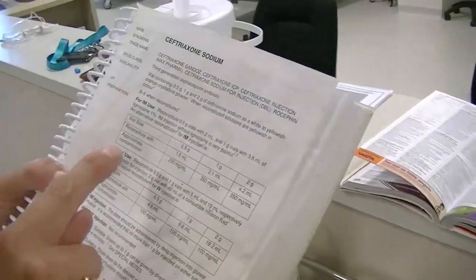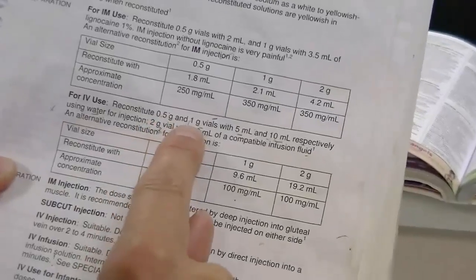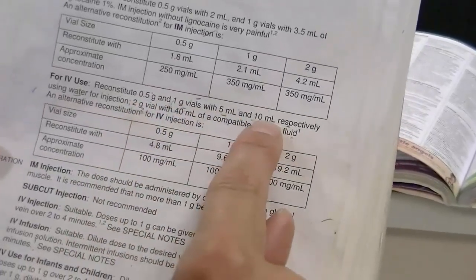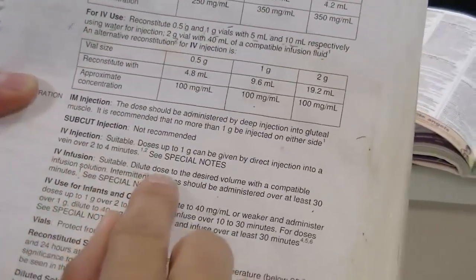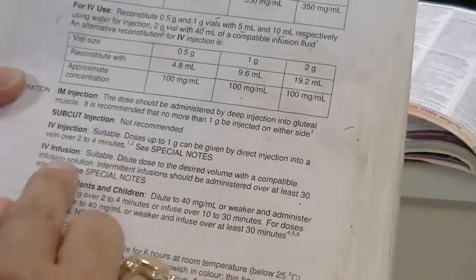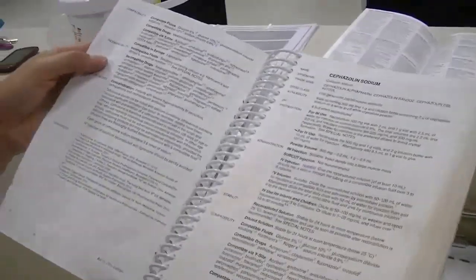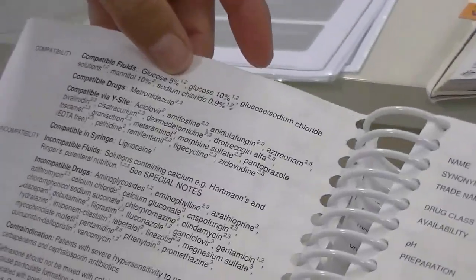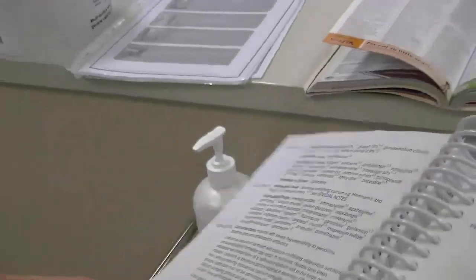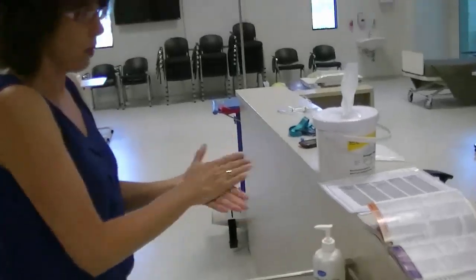Now I've got ceftriaxone, and for IV use it says reconstitute 0.5 grams or 1 gram vials with 5 ml and 10 ml of water respectively, and I can give it as an IV infusion, dilute to desired volume with compatible infusion solution, and administer over at least 30 minutes. Compatible infusion solution would be, here we go, sodium chloride 0.9%, 5% glucose, and I'll just check that I actually have that as my IV fluid. Now I will prepare the drug.